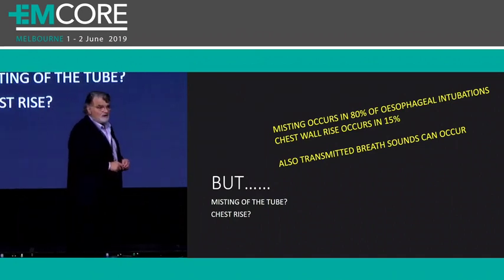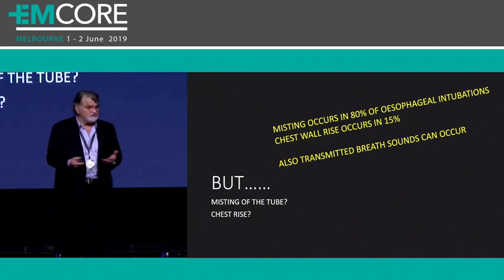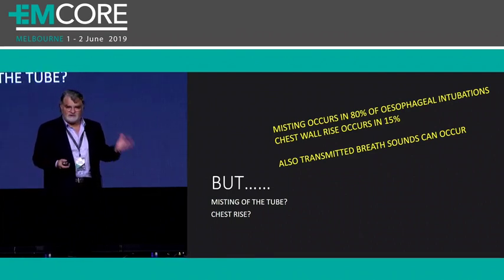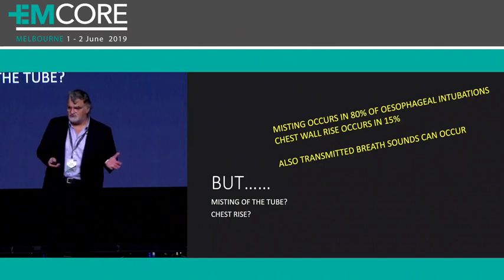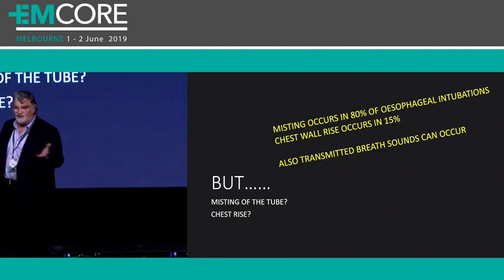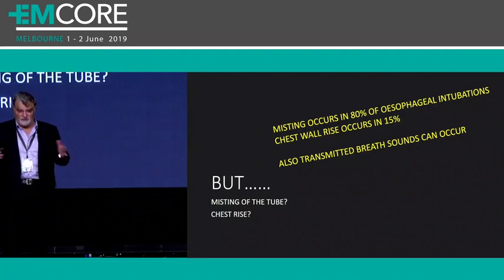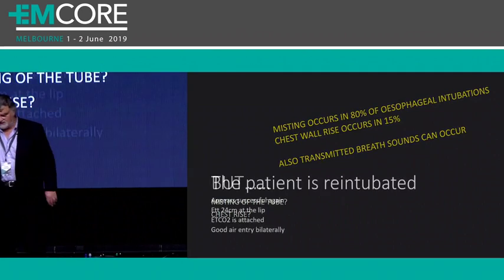Transmitted breath sounds occur, and I've actually heard transmitted breath sounds that sound just like it might be in the lungs, and you're fooled. What's the end-tidal CO2 show? That's the question we need to ask. Chest wall rises in about 15% of esophageal intubations, as you'd normally expect it to. You're looking at the chest wall, you've intubated, it rises, it's esophageal. So we don't trust those, we trust end-tidal CO2.